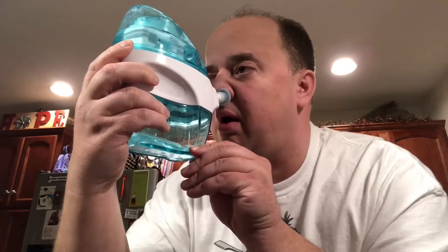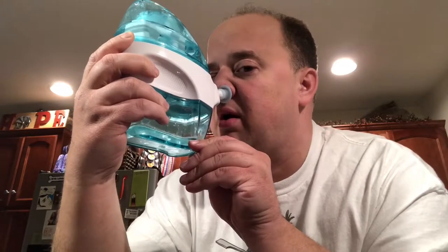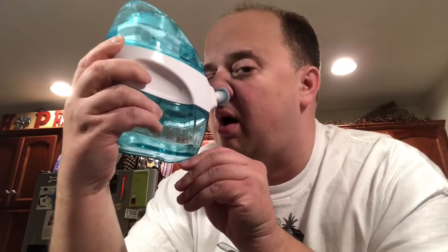And there you see it working, going through the sinus cavity. I don't really feel anything else.